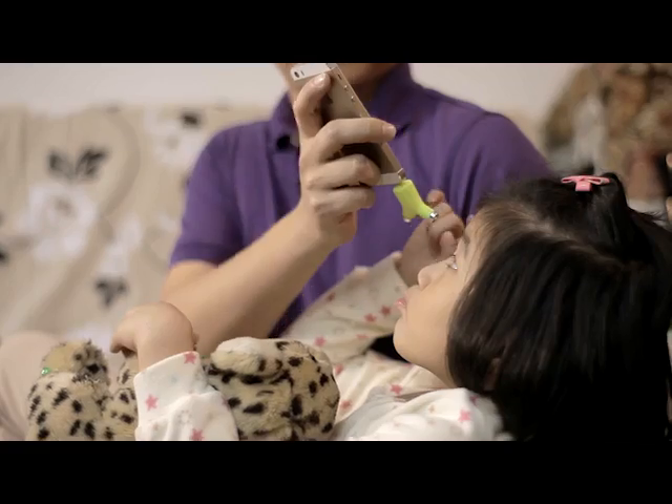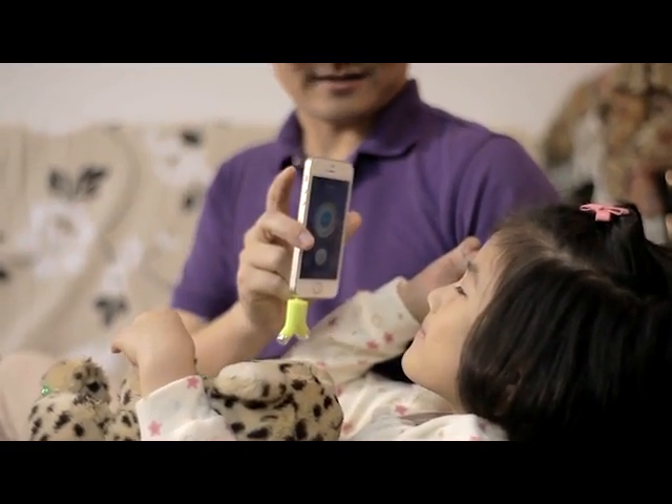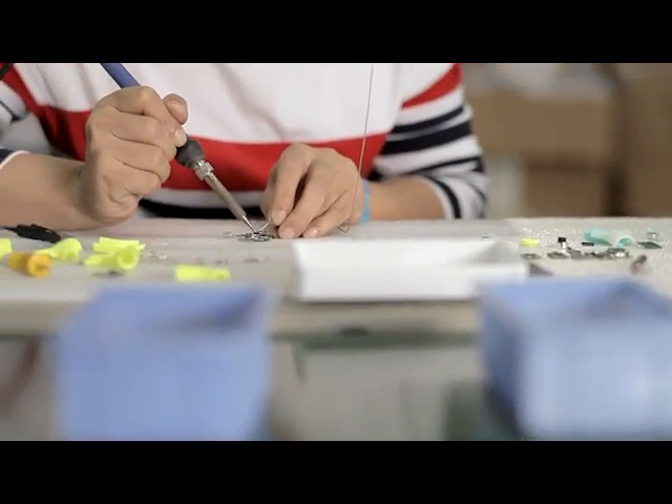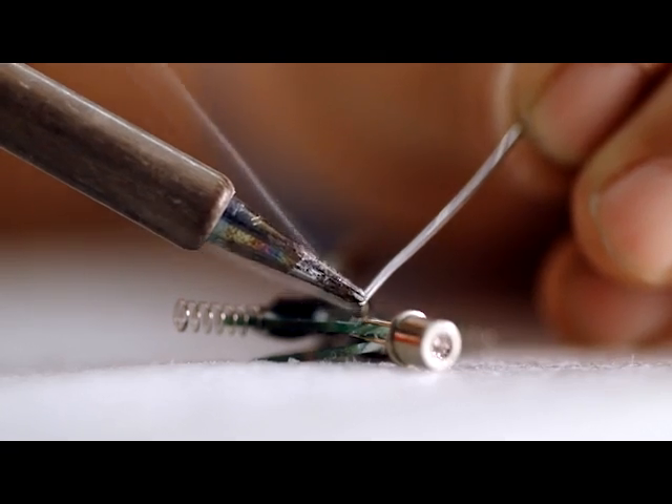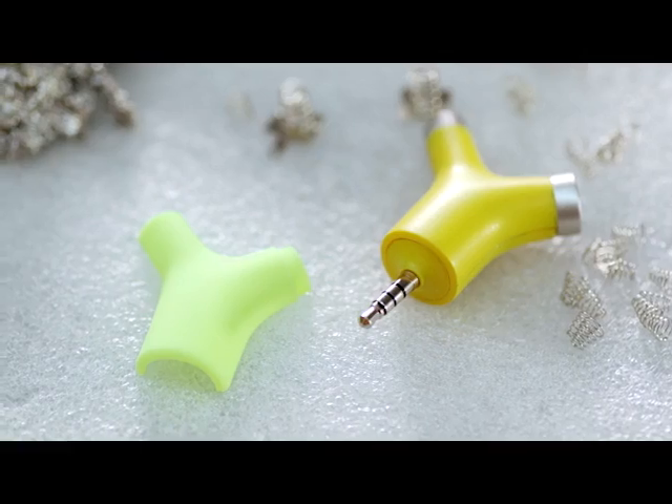As a father and a baby product store owner, I know the hassle of taking a child's temperature from my own experience and from my customers. I created Wishbone to make it easier for parents to check temperatures and monitor their health.